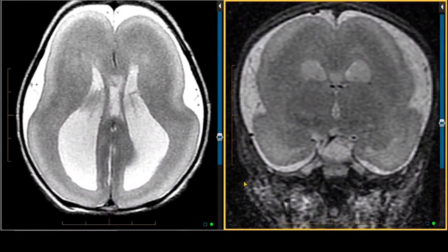This is an MRI of the brain in a 1-week-old child that had an in utero abnormality that wanted to be further characterized. One of the first things we see is this very, very featureless surface sulcation pattern to the brain. We're seeing a rudimentary sylvian fissure on both sides. At most, it looks sort of like a large figure 8, but we're not seeing any other major sulci.